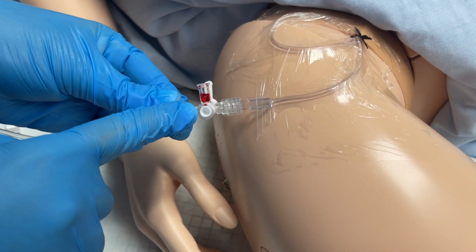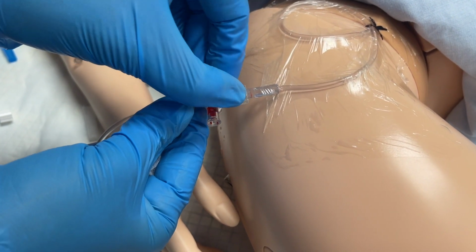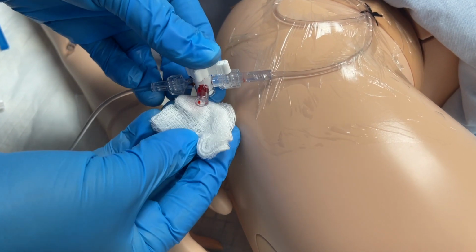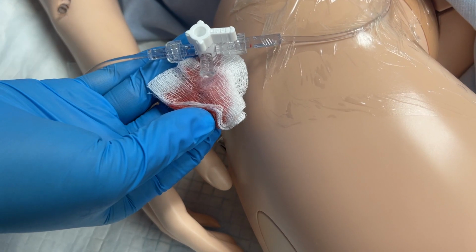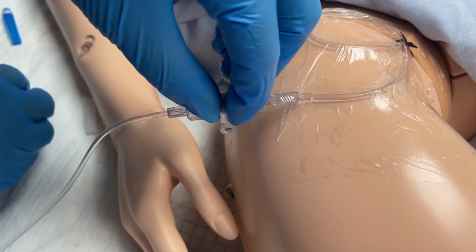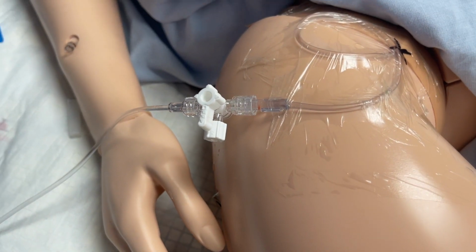It is imperative that we flush this blood out, as stagnant blood causes infection and can also occlude the line with a clot. Turn the stopcock towards the access site, which will block off any backflow of arterial blood. This opens up the lumen between the port for air and the line. Place a clean gauze just under the opening of the port and go back up to the transducer and flush the line again. This will utilize flush to push through that port and clean it appropriately. Replace the cap and then turn the stopcock back off to the air to resume hemodynamic monitoring.